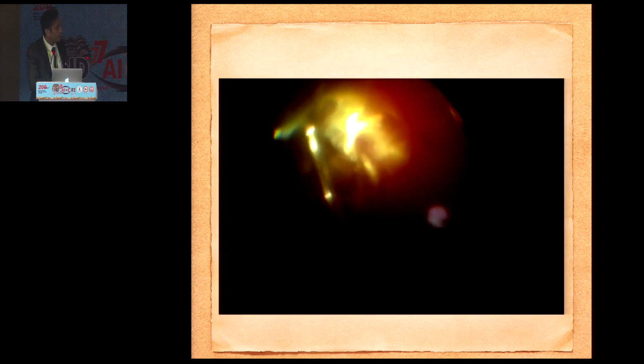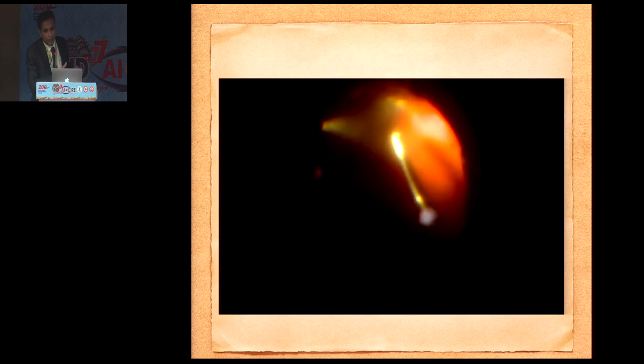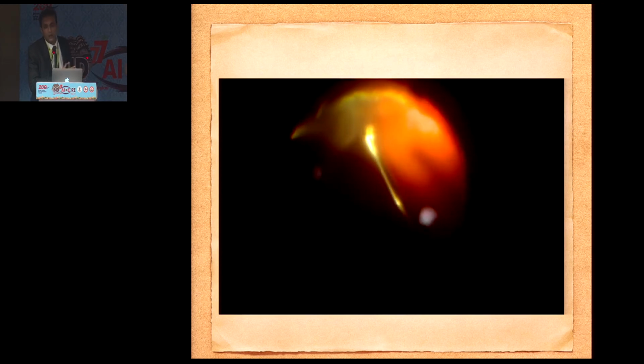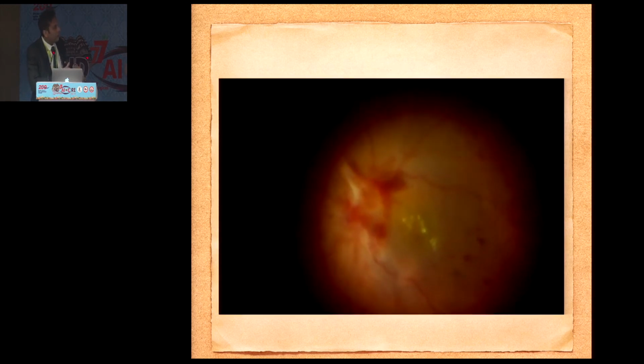So this is a dense vitreous bleed. The dictum is to truncate the cone and create a hole in the hyaloid, so all the subhyaloid bleed comes out. So you can have a better view of the anatomy of the various attachments of the proliferation. There's no point in going towards the posterior pole first. First go in the periphery, clear it up.